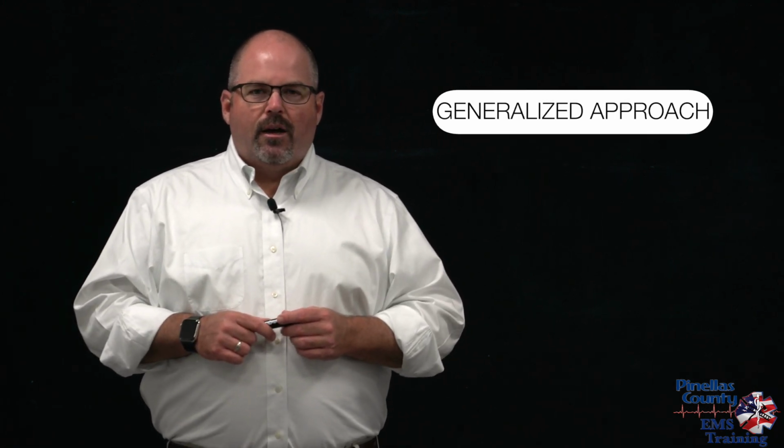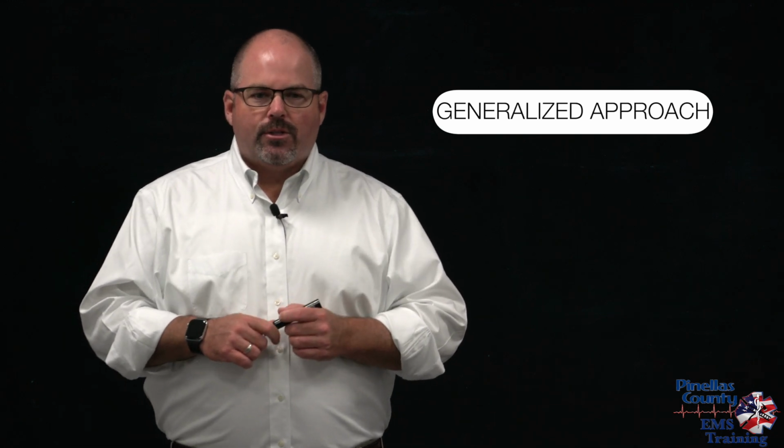An example of this is when reading a chest x-ray. If I look straight to the lungs, I might miss other things. So they taught us, be sure to look at the vessels, the bones, the heart, the aorta, all that stuff before you actually look at the lung fields themselves. So similarly for an EKG, there's some things you really need to look at before you get to the ST segments. And so we'd like to take a little while and just go through the generalized approach that you can use to do this, and then we'll get into some of the specifics about things to look for.